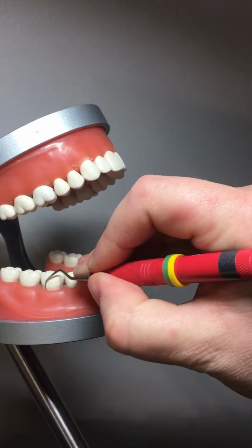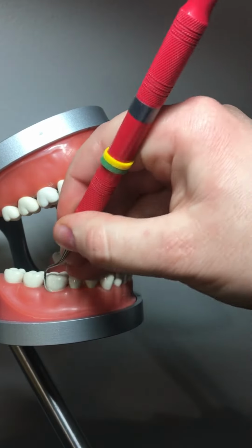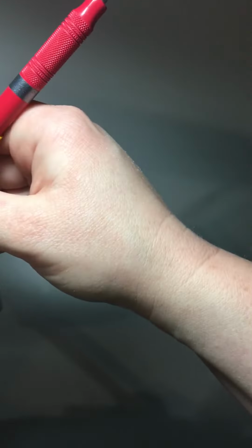Same thing with horizontal. I'm using wrist activation with all three of these strokes. So here's my wrist, here is the vertical, here is the horizontal, and here is the oblique, all wrist.